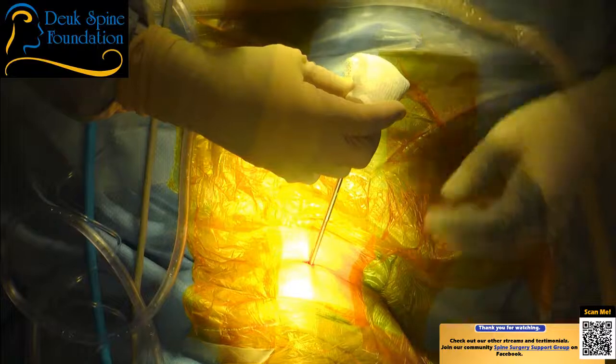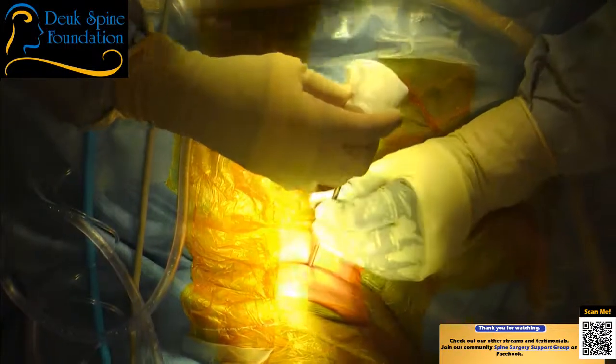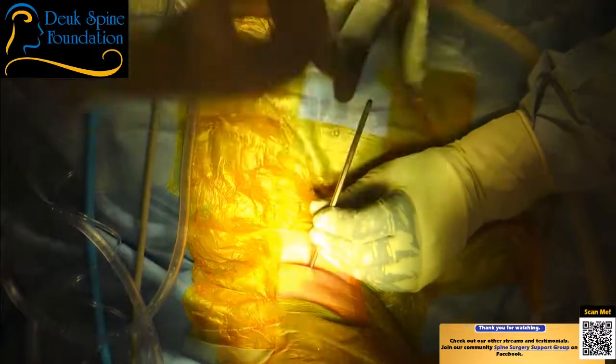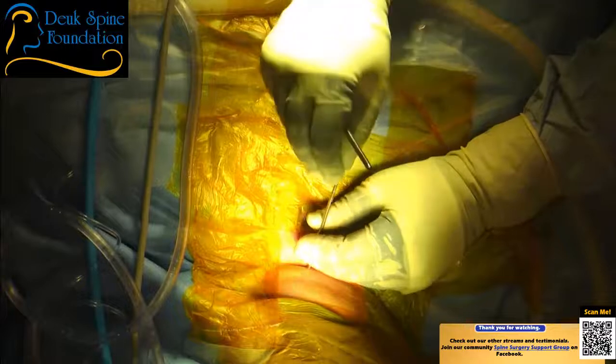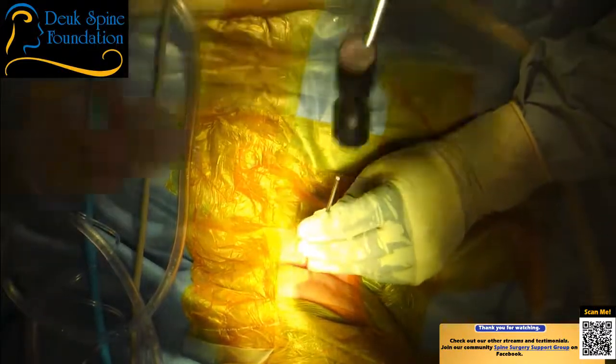And she was told she needed a fusion. She didn't want a fusion. Shot. Neither of these patients wanted fusions. Okay, the dilator moved. I need to put it back. Shot. Yes. We have a question.